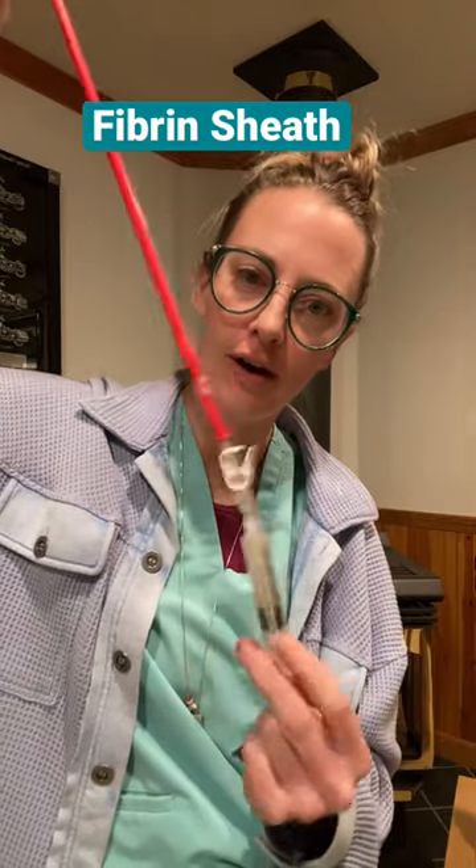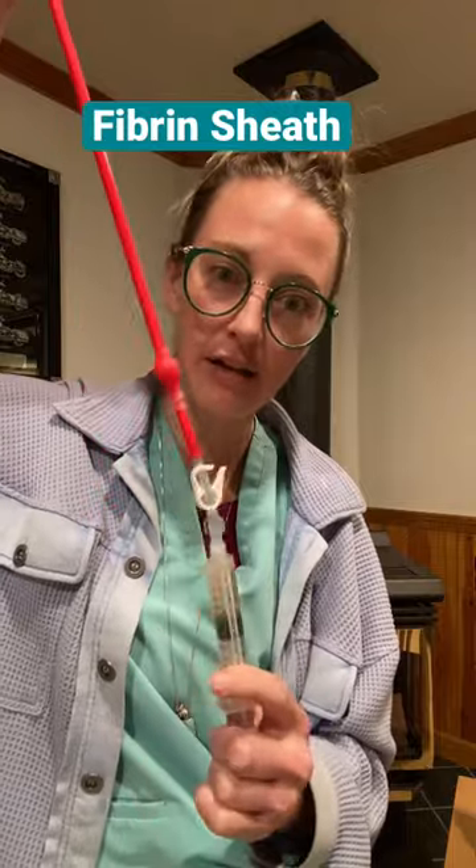The dreaded fibrin sheath — let me show you what it is. In a normal dialysis catheter, this is like half of a catheter. I can flush the lines, I can pull the blood out, and I don't have any kind of resistance.